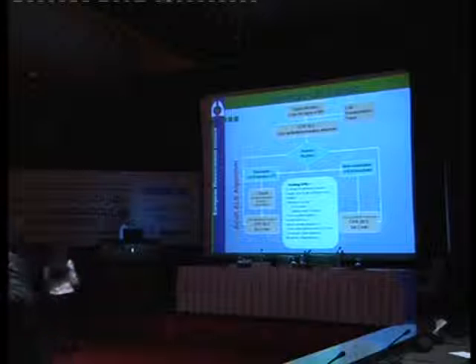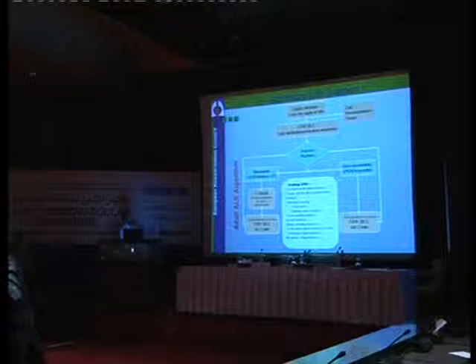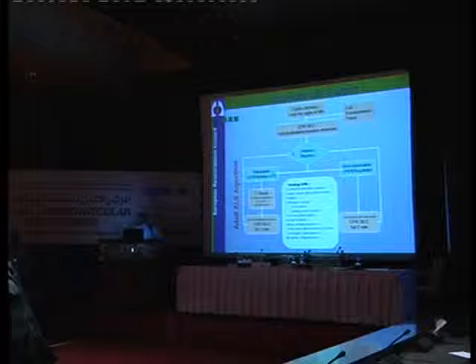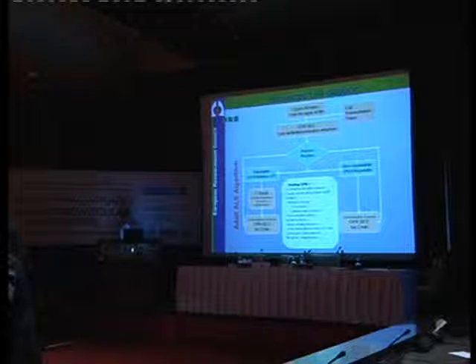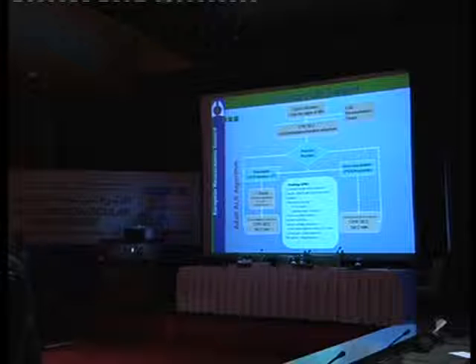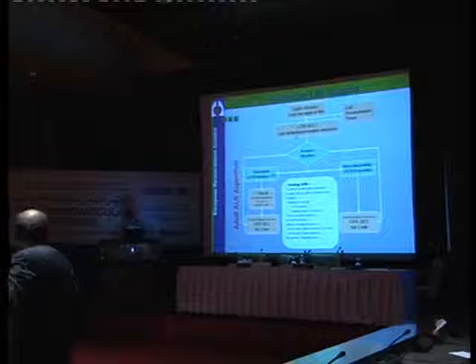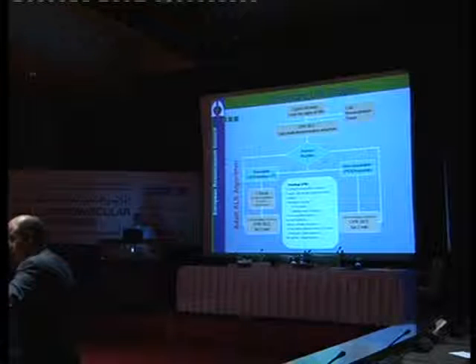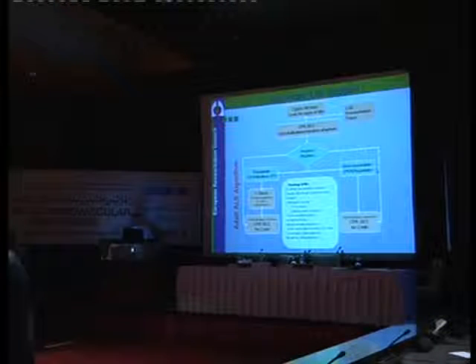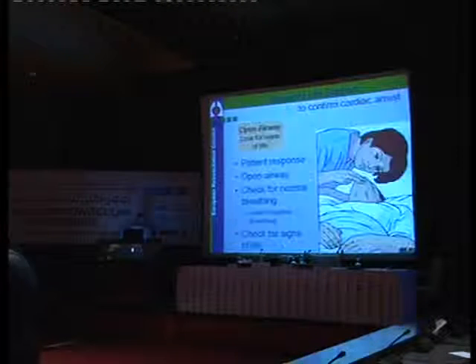You know this. The thing I would like to highlight again, look at this part, that is about diagnosis. The first diagnosis, then you start the treatment. And this lozenge here is when your cardiac monitor defibrillator comes in. So clinical diagnosis, then an ECG diagnosis. These are the 2 steps. And there are 2 wings of the management depending on what your ECG monitor will show you. After your clinical diagnosis, when you have done the basic life support, your ECG monitor comes in, and if it shows you a shockable rhythm, then you go on to the left hand of the algorithm. If it shows you otherwise, then you go on to the right hand. And in the center of the algorithm are the common actions which you do in all cases.